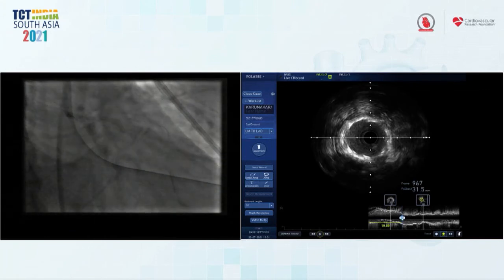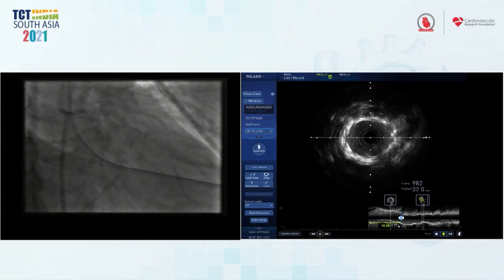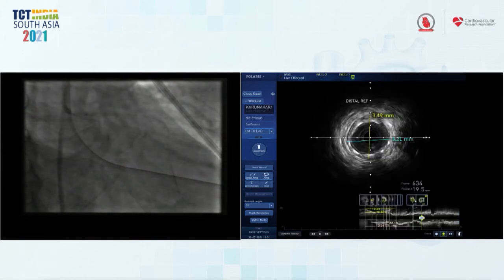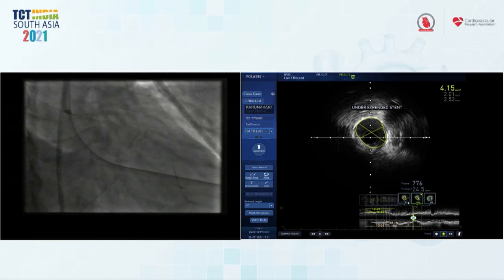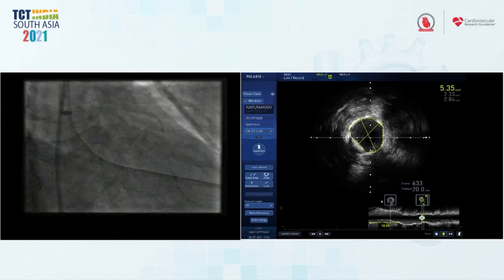So we're just doing that ostium of the left main with a higher pressure. So this is a 3.5 at 24 atmospheres, just to open it up as much as we can. All the time the guide is floating, and it's not touching the struts. Okay, and then I use that balloon quietly to get the guiding catheter in so that it doesn't touch anything, and then pull the balloon out, and we take some shots now.